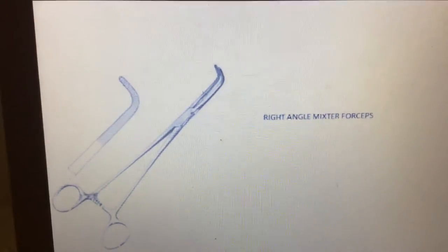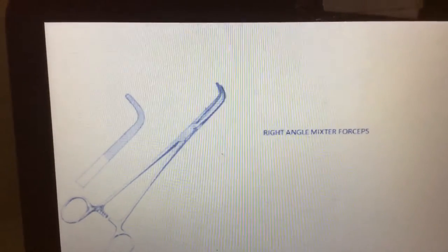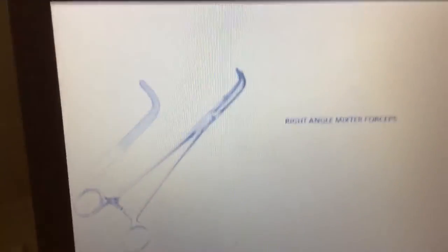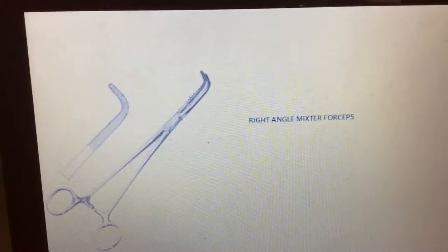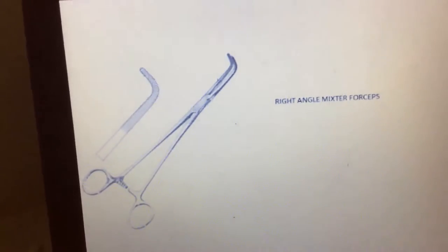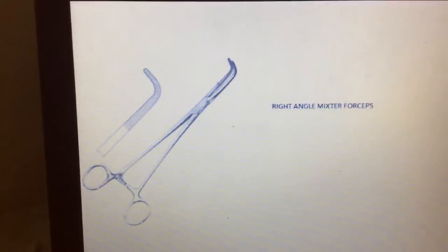We are discussing commonly used surgical instruments. This one is the right angle mixter forceps. It is called the right angle mixter forceps because of its right angle shape. It is mainly used for deep artery clamping, because some arteries are very hard to reach, so we use the right angle mixter forceps.